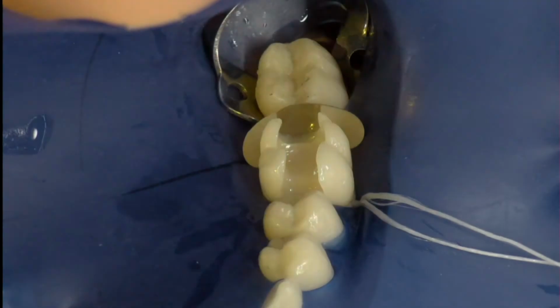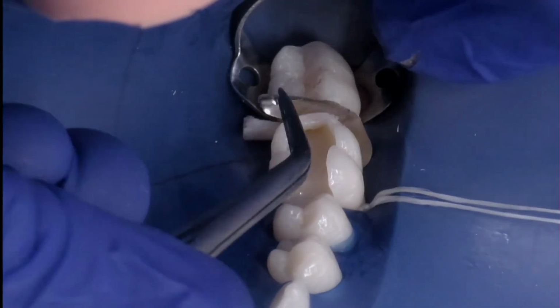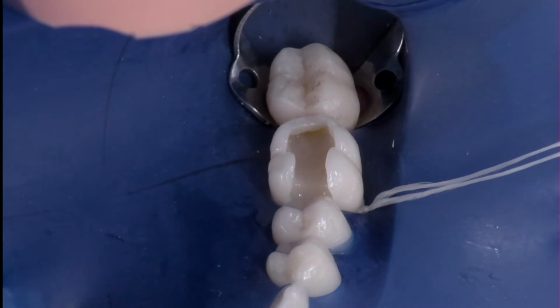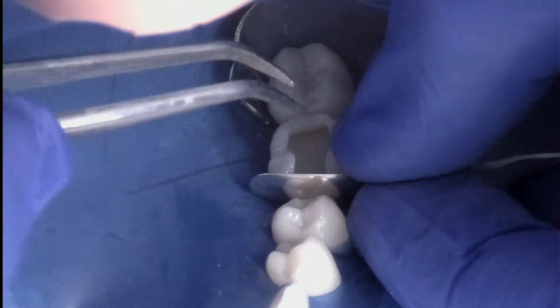We're using the Garrison sectional matrix system. I've had some troubles with it with these typodont teeth, but I think this went pretty well this time. And the camera cut out, so I made the distal marginal ridge prior to and while the camera was cut out, so we kind of missed that part of the video. But here's the mesial marginal ridge.